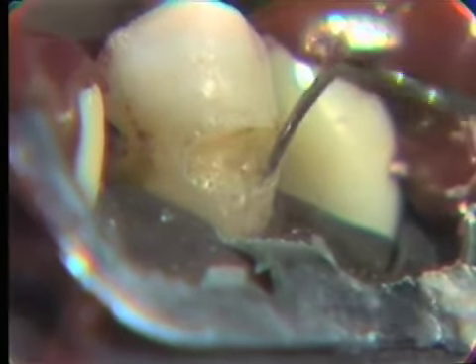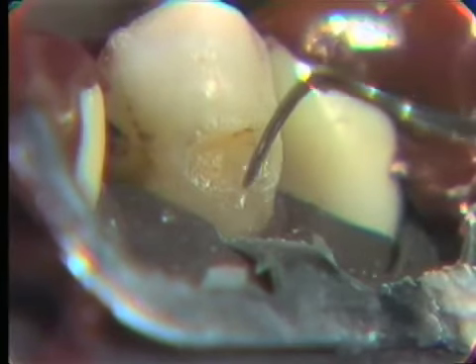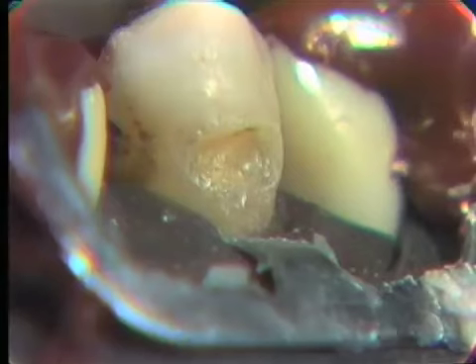We want to be able to feel it. We want to be able to run the explorer along the retentive groove in dentin. Retention is cut in dentin. It allows a bit of dentin between the retentive groove and the enamel wall for support. The retention is not cut right at the dental enamel junction.